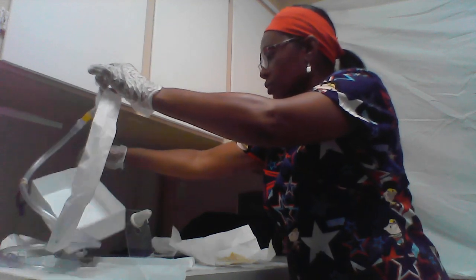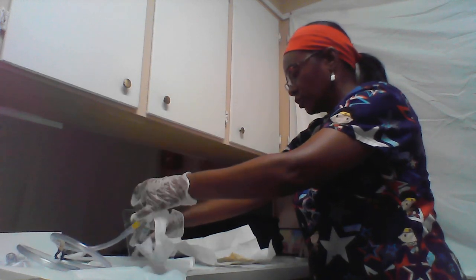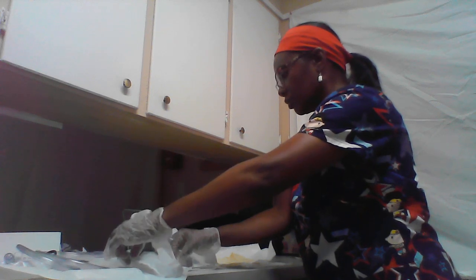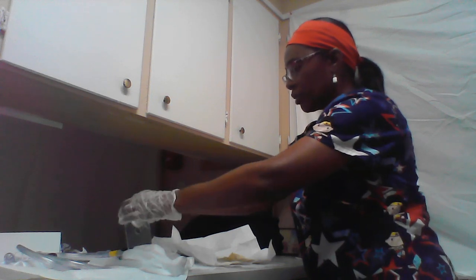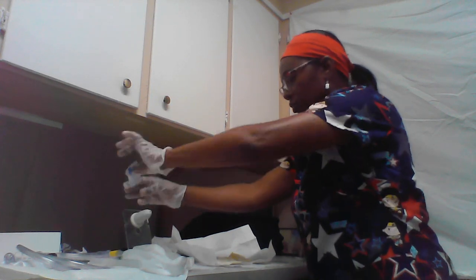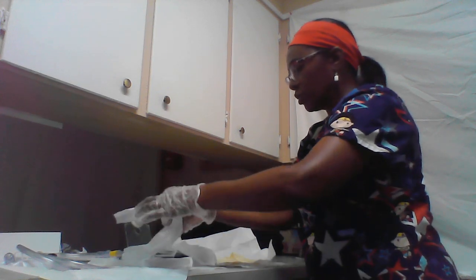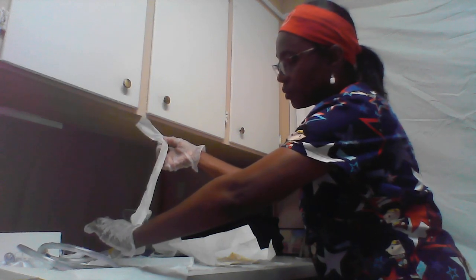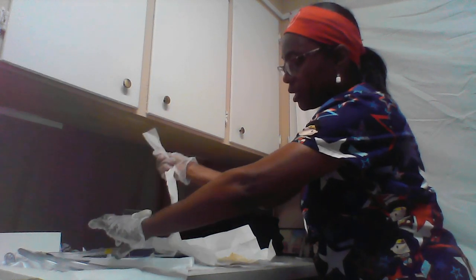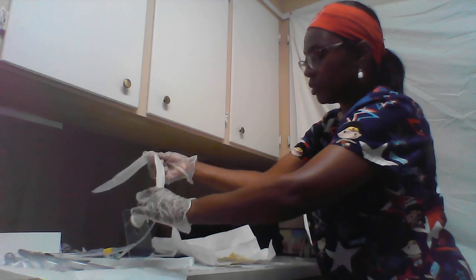Taking the catheter out, removing this, keeping everything in sterile field. In sterile field, and I have my gel. I'm going to coat the catheter with gel. Open the gel, insert it in the tray, and I'm going to coat the catheter. And now my hand is still sterile until I touch the male's penis.